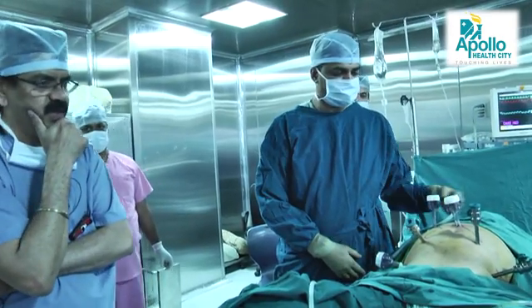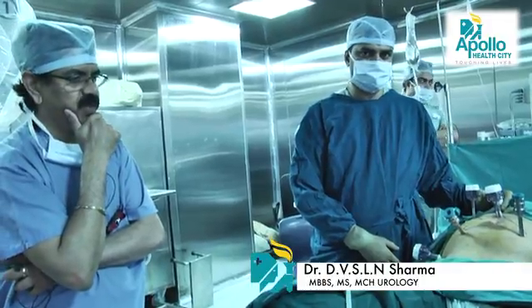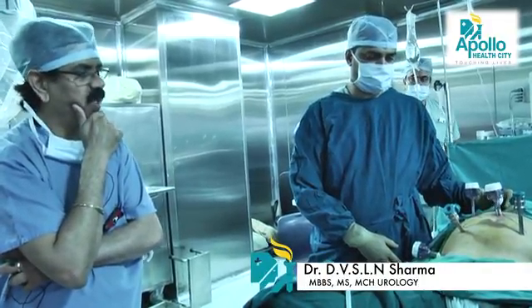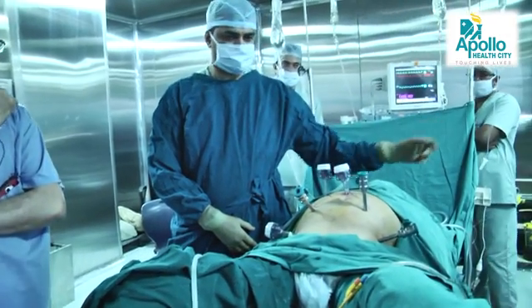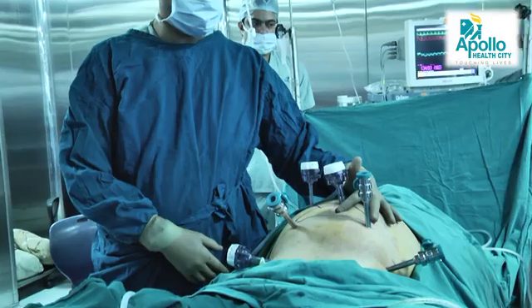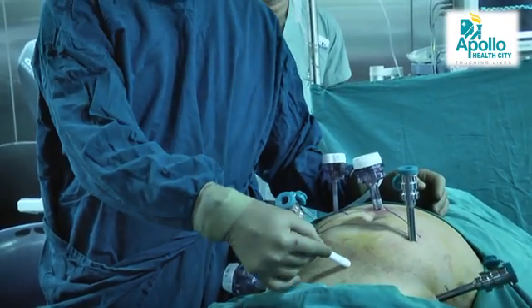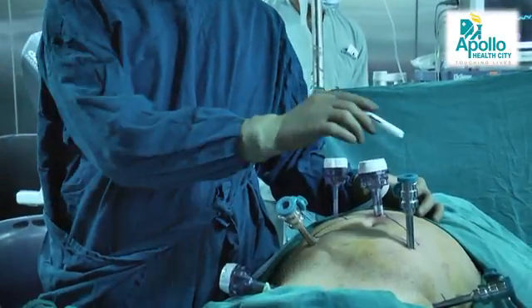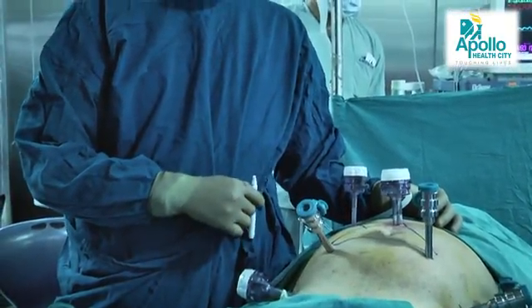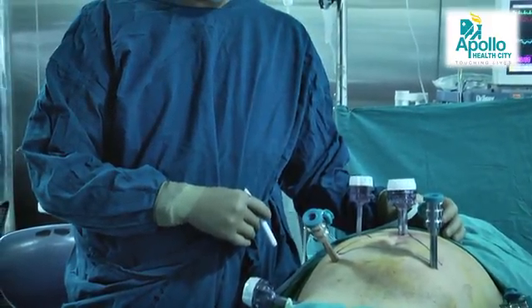This is the position of the patient before we dock the robot. Normally you would look at the umbilicus — the incision starts from there, and a long midline incision would be made from that point downward. Instead, now the whole procedure is performed through three small holes, and through one of the holes the specimen is extracted, after which the patient is shifted out.